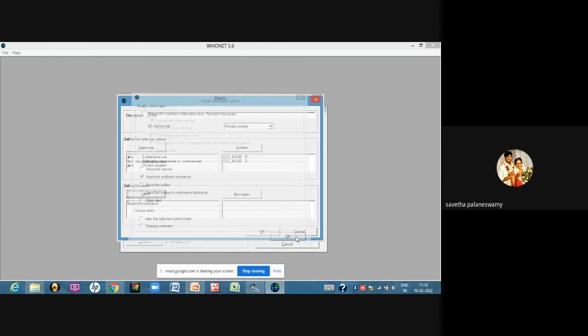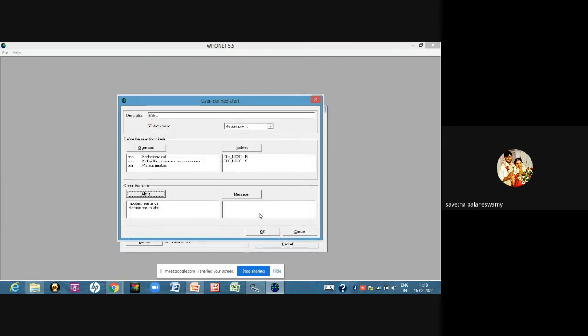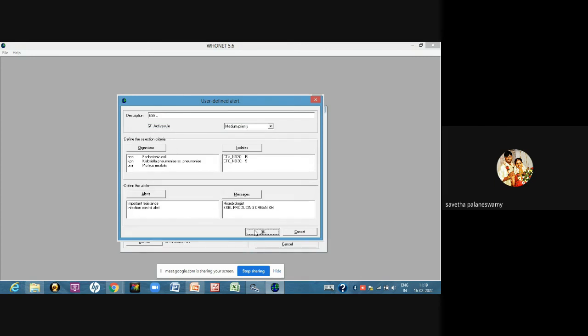These are the alerts I want to display. So I have done. Just click OK.